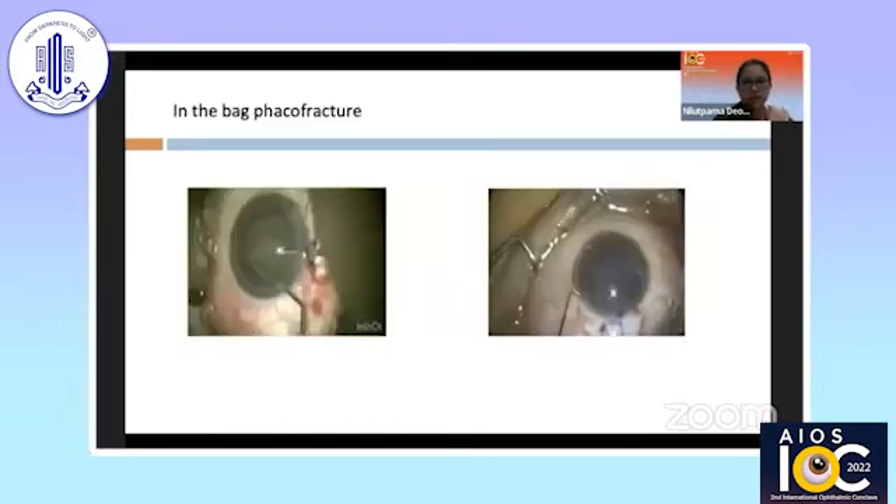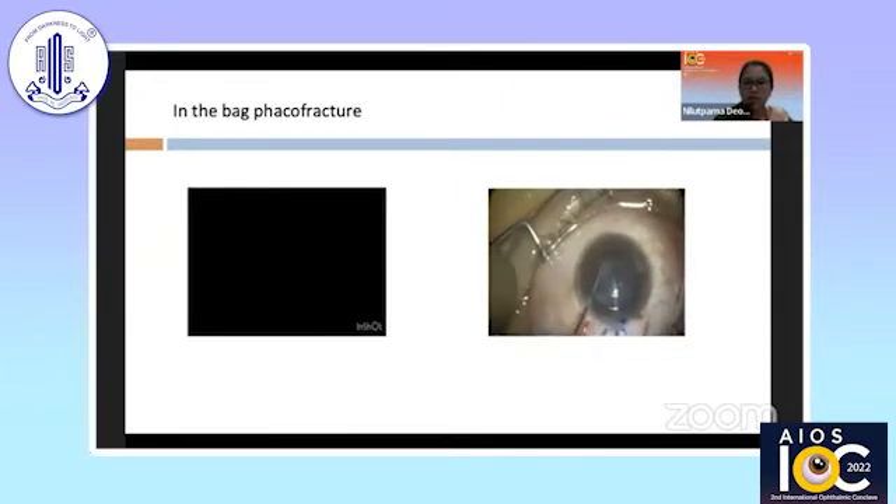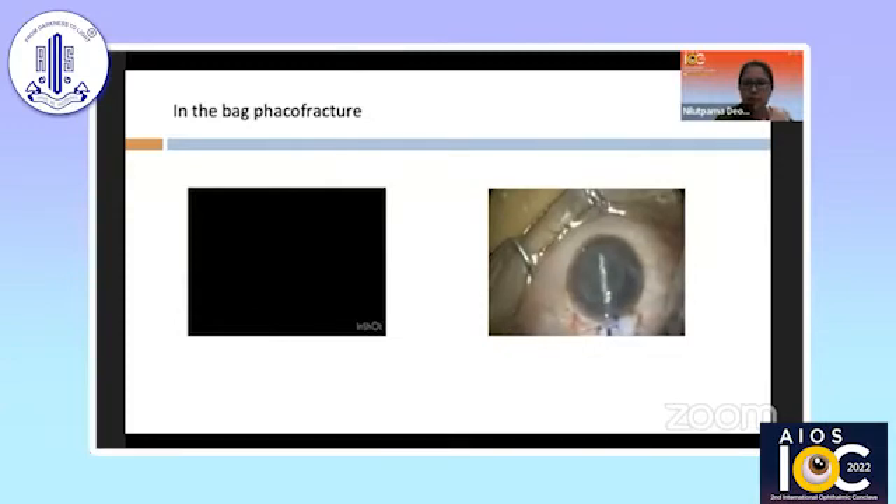Even with a harder nucleus, you can proceed with fracture of the nucleus in the bag. In the case of a soft cataract — as shown in Dr. Amalya Sahasar's video — the soft nucleus is easily fragmented in the bag. The flat instrument, the iris repositor, is used rather than the vectis to deliver the nucleus into the AC, as this prevents further injury to the endothelium and the iris. Instead of the sturdy vectis, we deliver the hemi-nucleus fragments using the visco delivery technique — simply putting in visco and expressing the nucleus out of the anterior chamber. Phaco fragmentation in the bag is therefore possible with this 2 millimeter technique for both soft and hard cataracts.